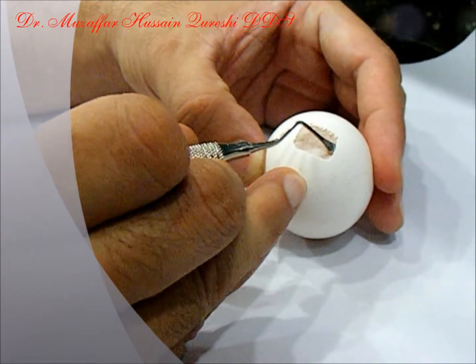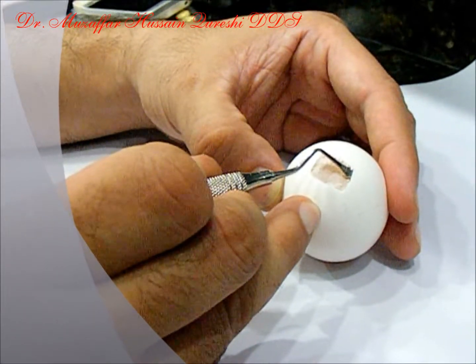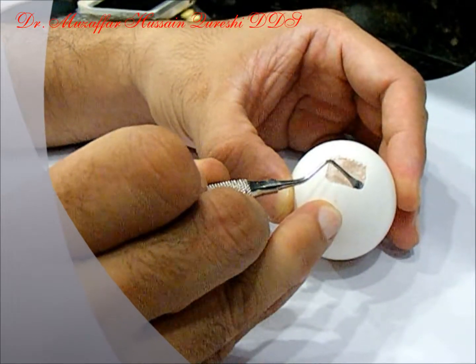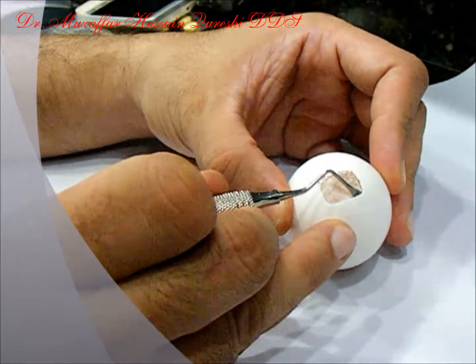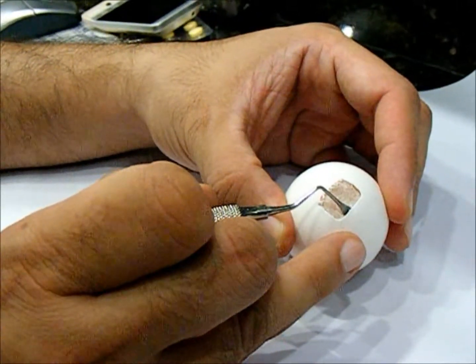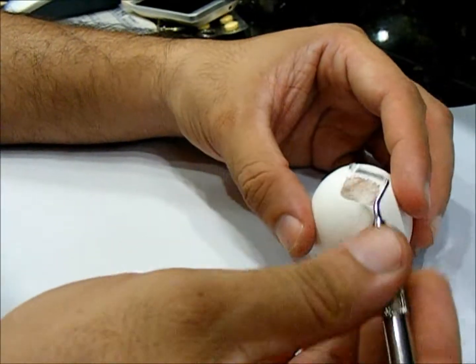I want you to realize one thing: this egg is a great example to use, but the membrane of this egg can rupture much easier and faster. Do keep in mind that the Schneiderian membrane in human beings is much more dense, a little bit more thick, and not nearly as fragile compared to what you would get in a chicken egg. But nonetheless, to practice without any consequence of patient discomfort, tearing the membrane, and waiting six months for it to heal up, you can practice using an eggshell.